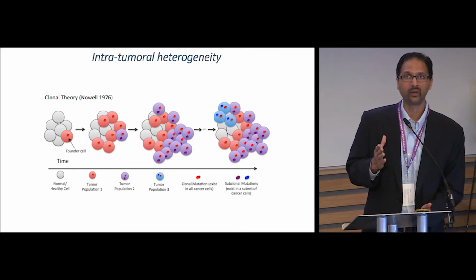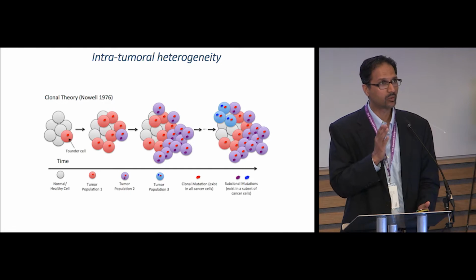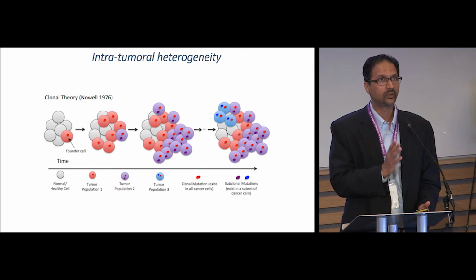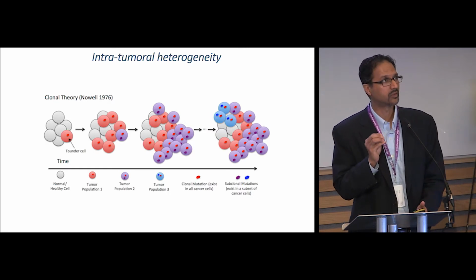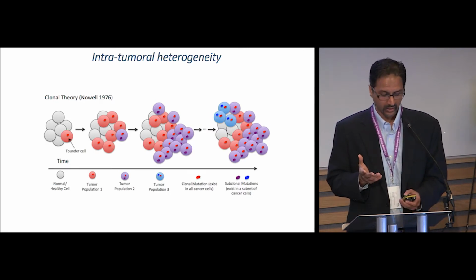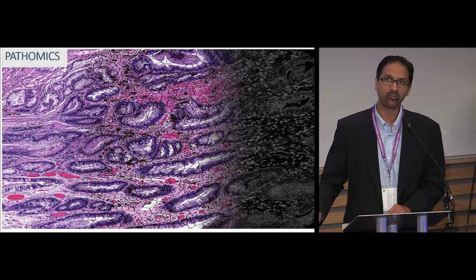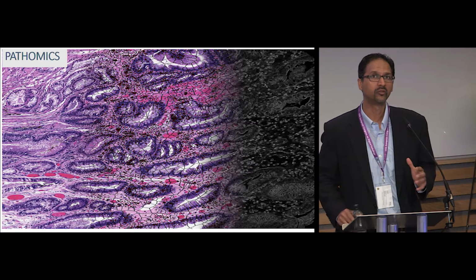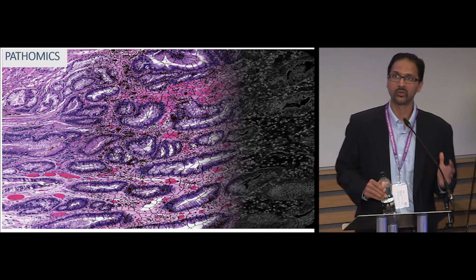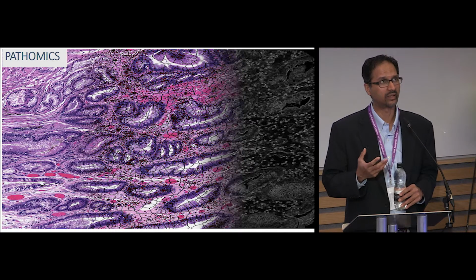But when you're sampling the tissue for molecular assessment or looking at specific genes or proteins, if you're only sampling a small part of the tumor, there's a real issue that you may not be capturing the most aggressive component of the tumor, right? And there's a recognition that looking at morphologic heterogeneity, or at features from routinely acquired data such as a hematoxylin and eosin stain slide, there is a lot of information one can get.